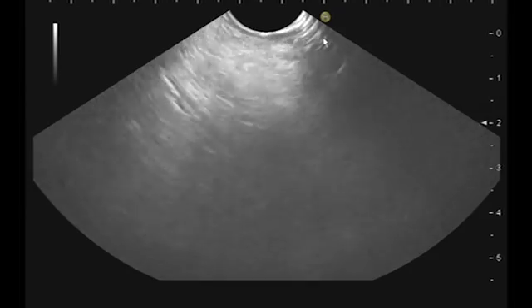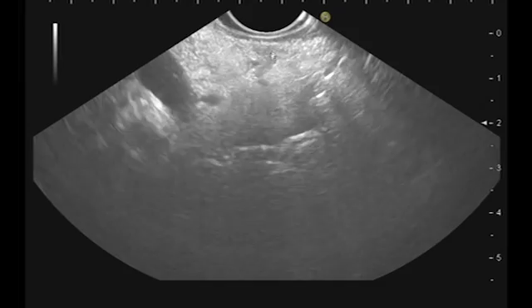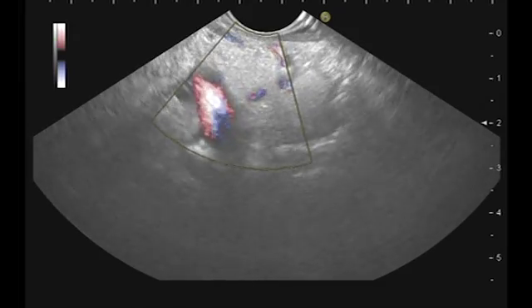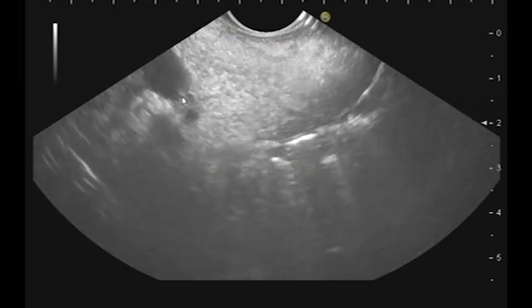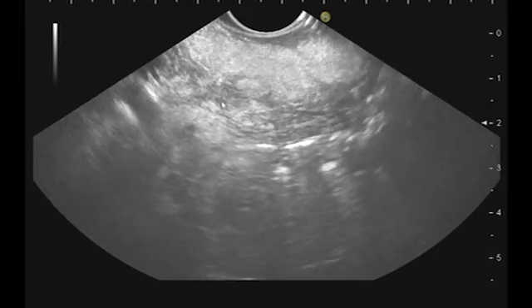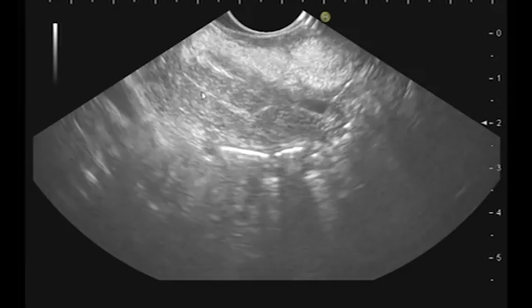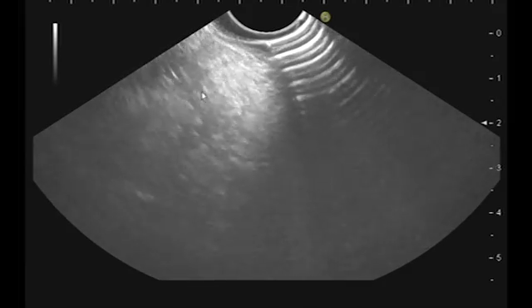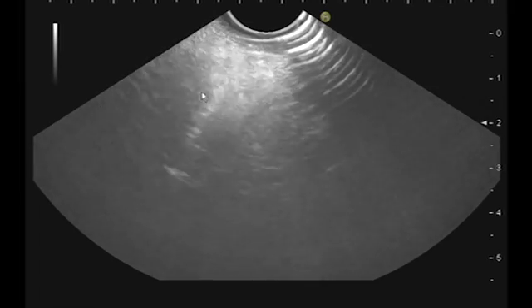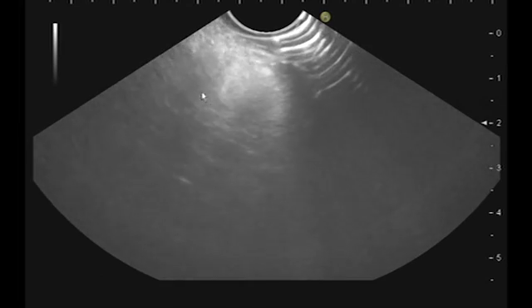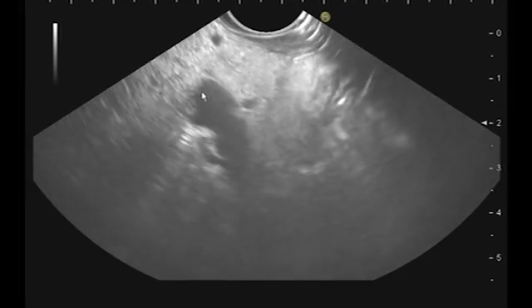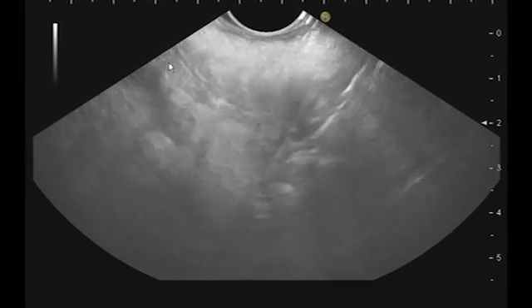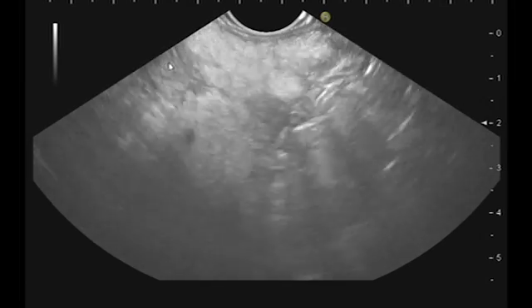Now I will go quickly into the bulbus to try to find the gallbladder. Here we have the head of the pancreas with the portal vein. This is the portal vein here. The head of the pancreas here. This is the isthmus. Here we have the pancreatic duct, which is very, very thin. And now if I do an anti-clockwise rotation, I will find the CBD. We saw that the CBD is probably here. And here there is no mass — it's a normal head of the pancreas.